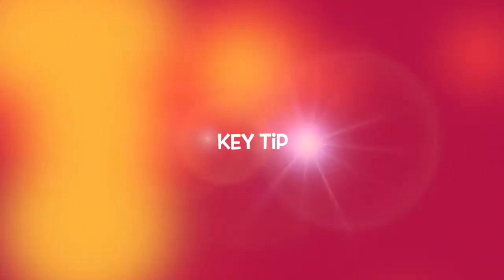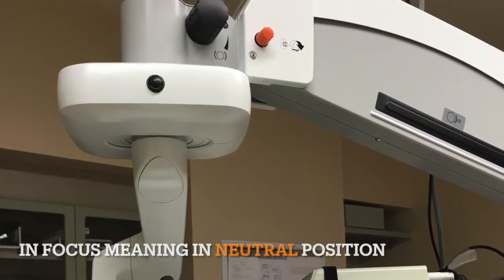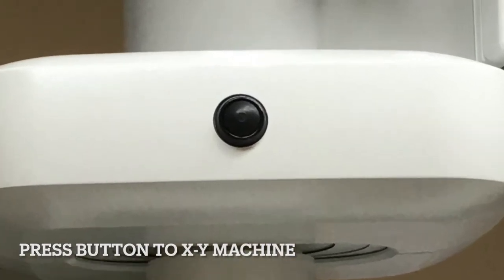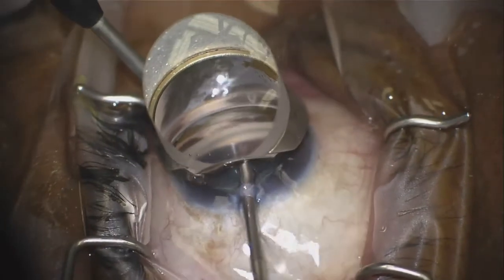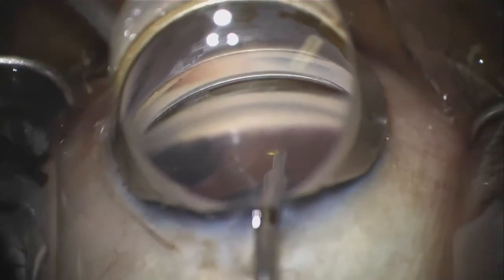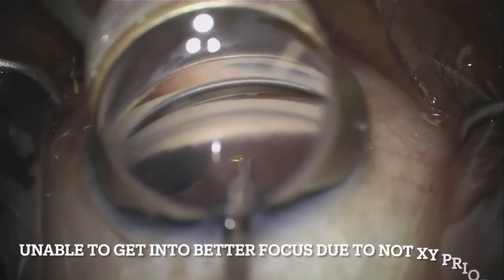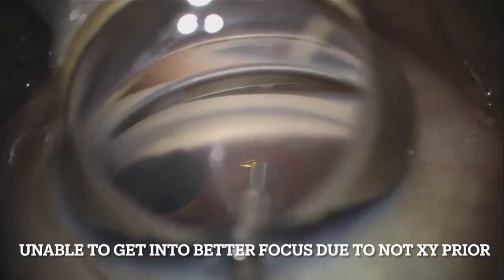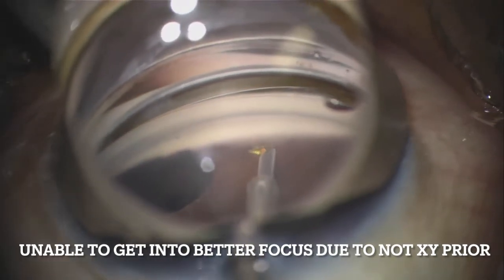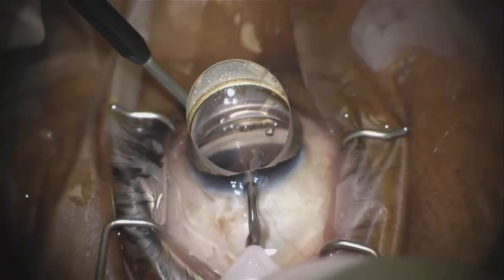Another important strategy is to always ensure your microscope is in focus by starting with the XY position centered prior to starting the surgery. MIGS angle surgery is done under high magnification, therefore completing this step will help to ensure that you have enough range to achieve high magnification. Oversight of this step may lead to inability to increase the magnification for greater visualization of important angle structures during surgery, as you may have exhausted the range of ability for any more magnification.